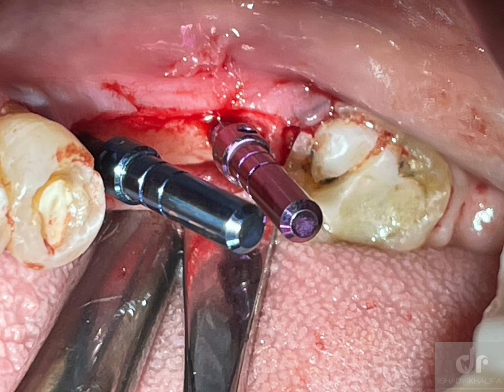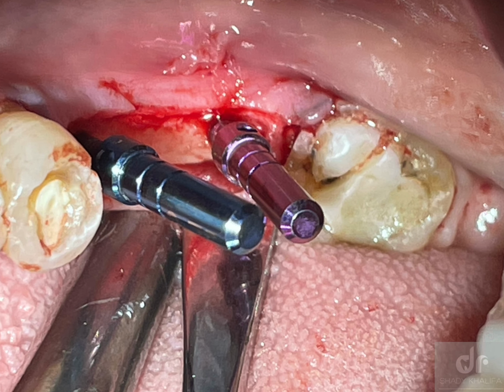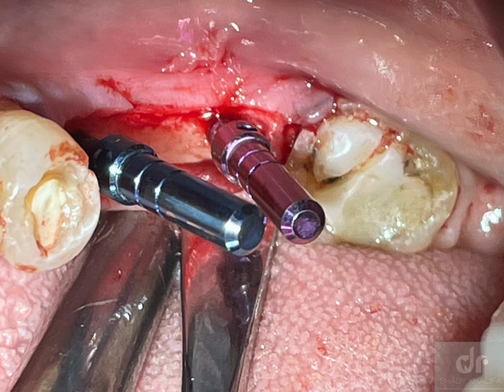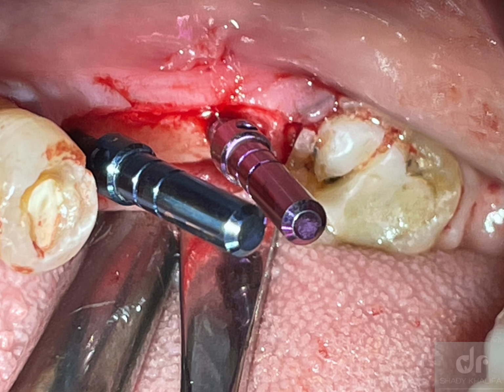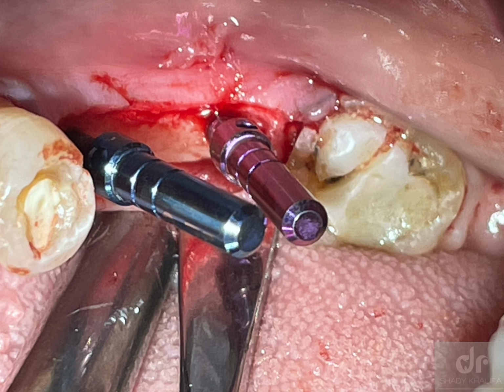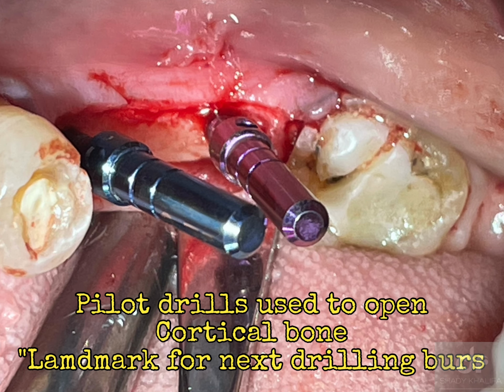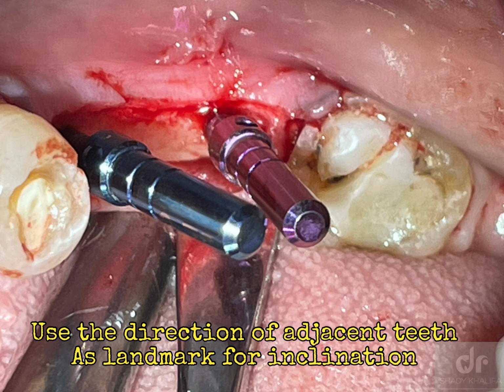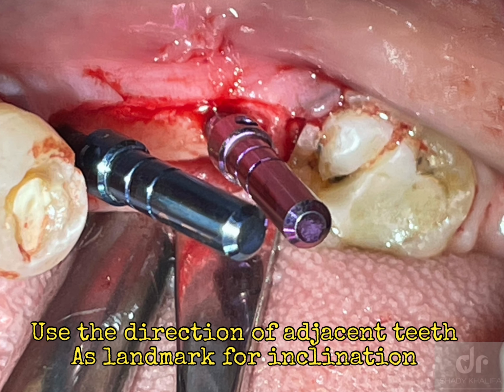This is the benefit of the parallel pins. As we said, the pilot drill should be on the center, so you can have buccal and lingual bone in the middle. Try to take the exact direction of the burr buccolingually and mesiodistally. Make your hand stable to not deviate. So take the direction of the adjacent teeth, how the adjacent teeth are inclined.